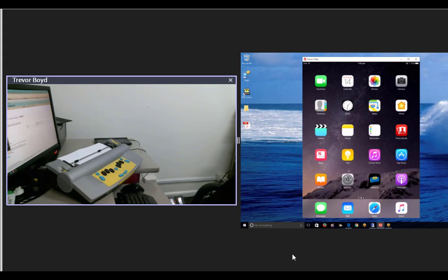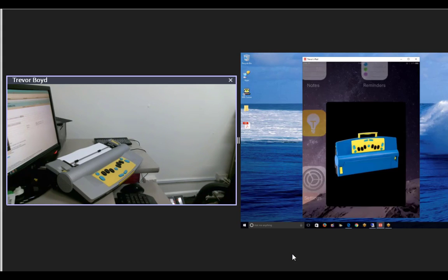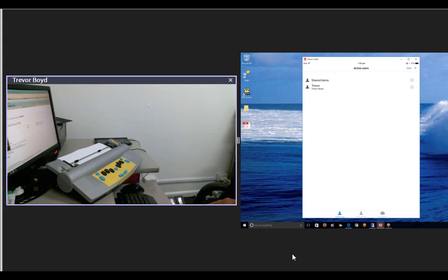So I'll just slide this over here. So that's my iPad, and down on the bottom line there's one called Mimic. The Mimic app is a free app. All of these apps that we've had a look at so far are free to download.